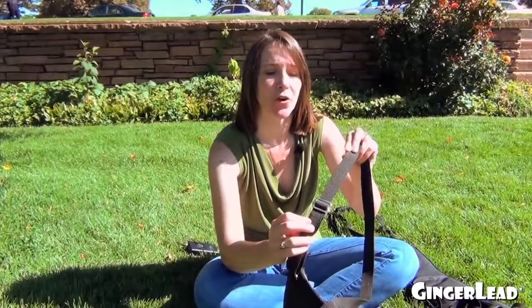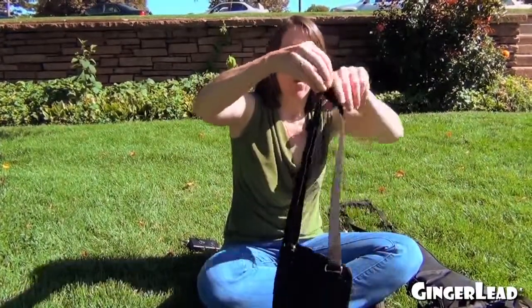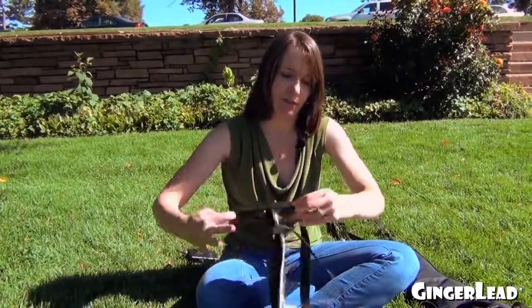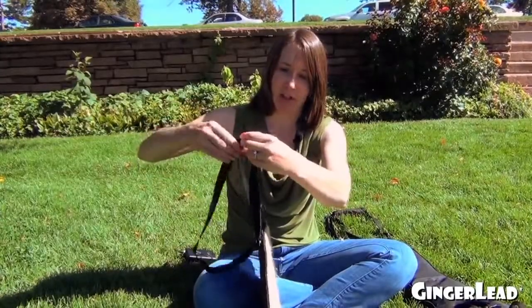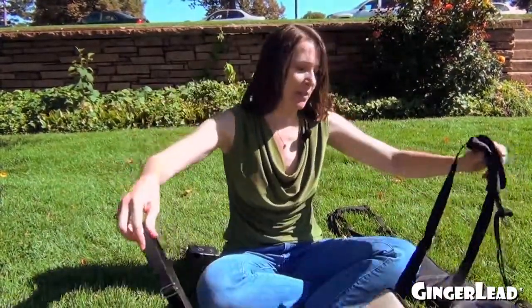The straps each have a silver slider on them that will make the straps longer or shorter, and you just move them from side to side. That shortens the strap or lengthens the strap. With a standard size Golden Retriever, I would put it on the shorter side, about right there. You want to make both straps the same size.